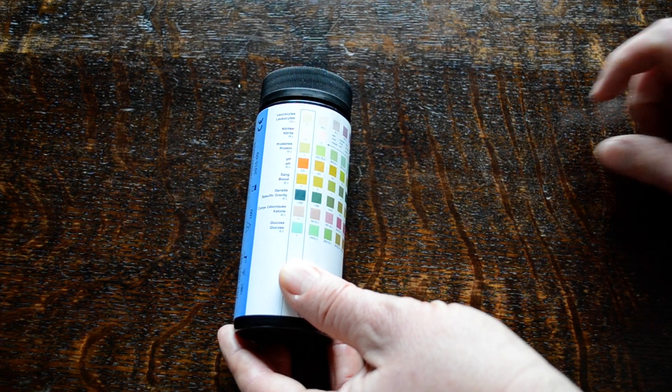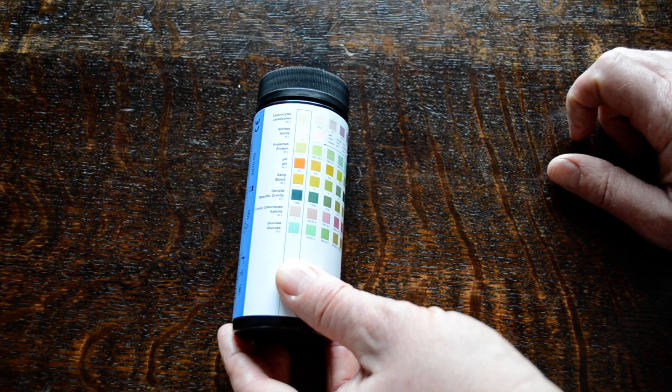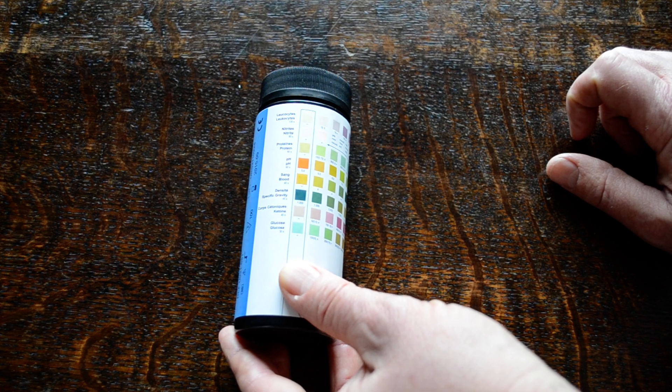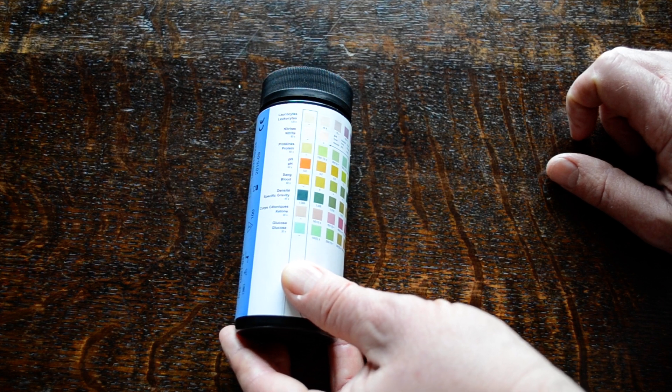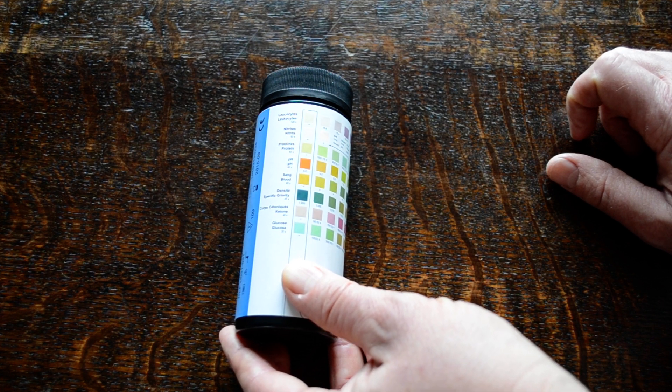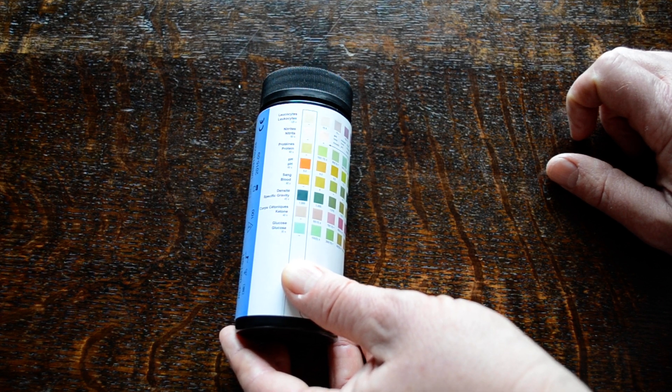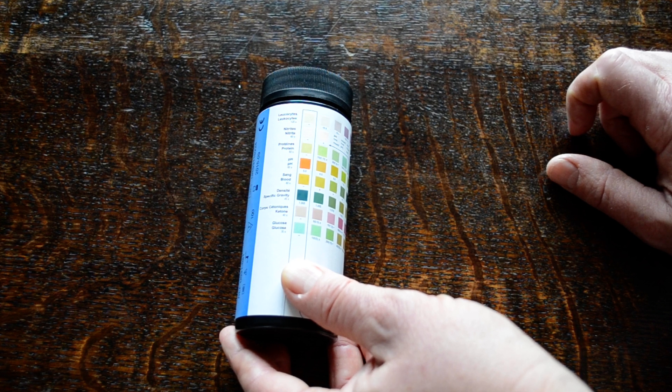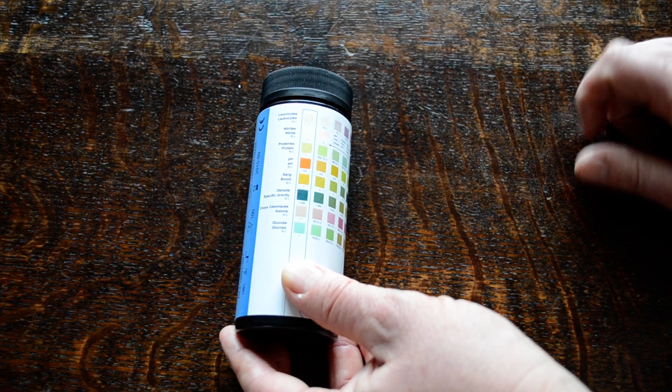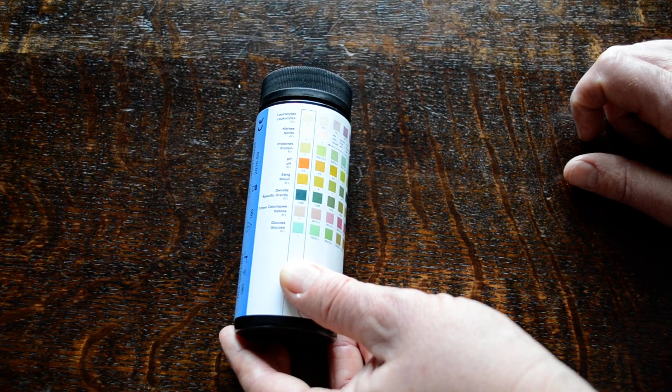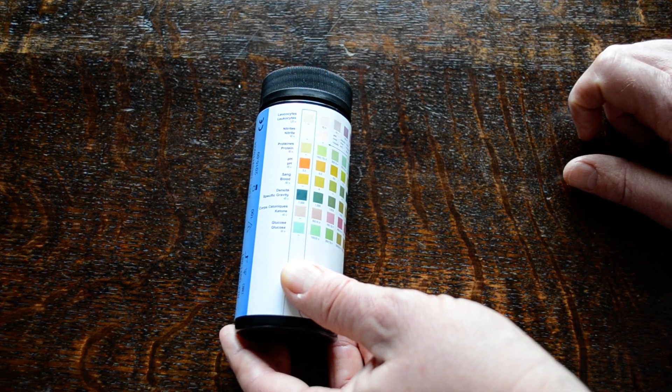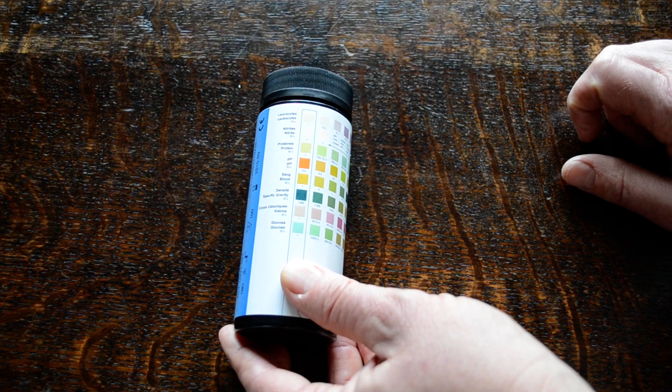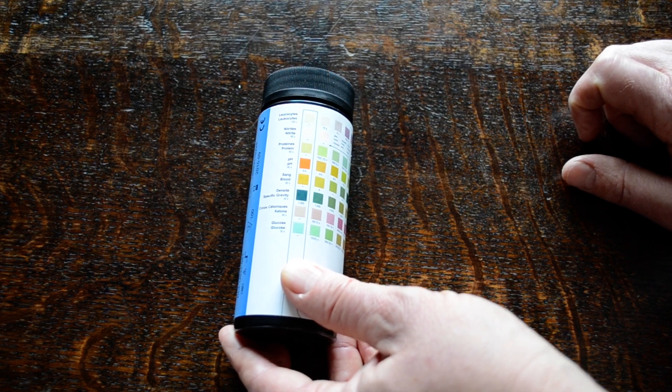Quite often in a severe or established case, you'll also get the presence of blood. So by looking at those key figures and also nitrites, which are again an indicator that something's going on in the urine, it will give you a good indication that something's not right.